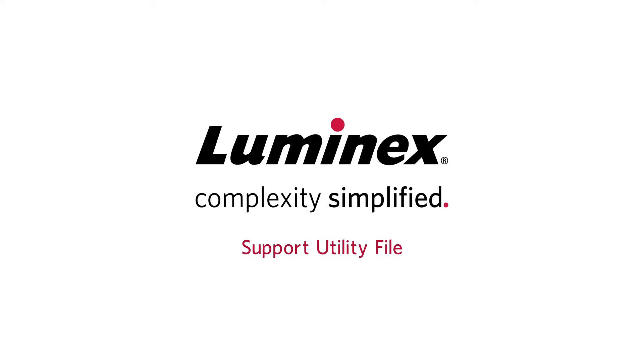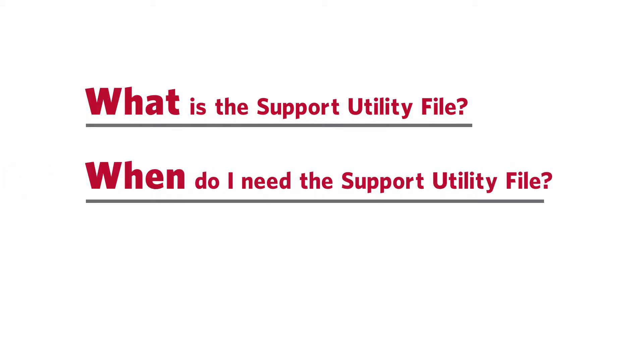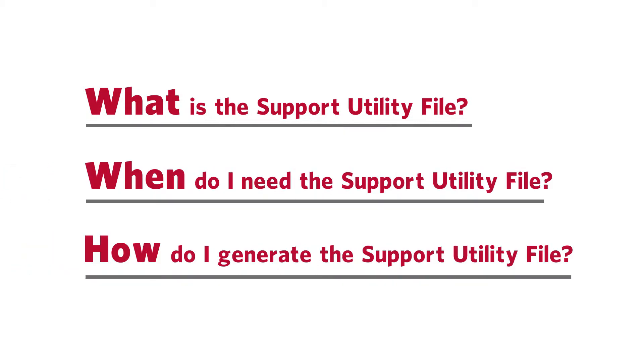Let's go over the support utility file for Luminex XMAP instruments. We will go over what the support utility file is, in what situation you would need to generate the support utility file, and how to generate the support utility file.